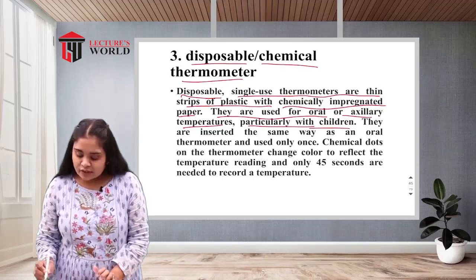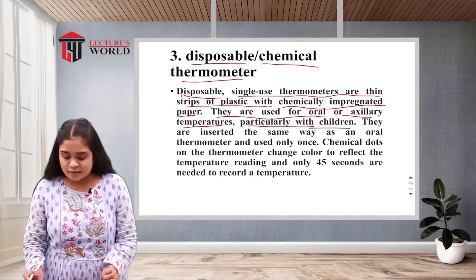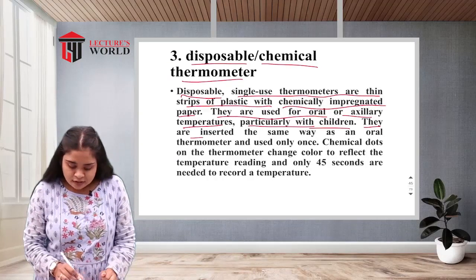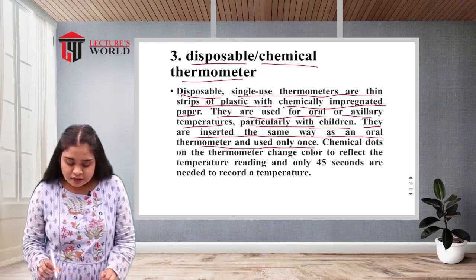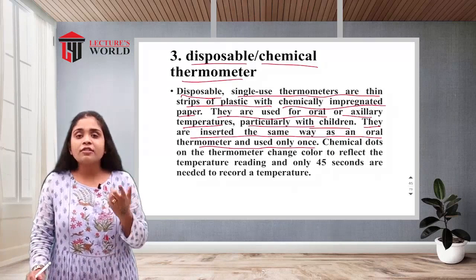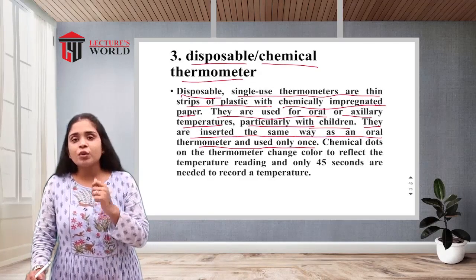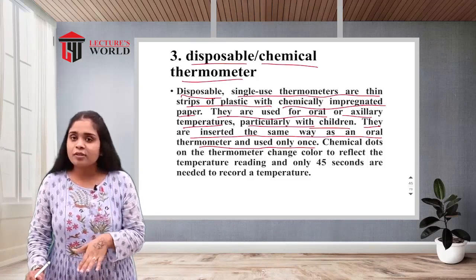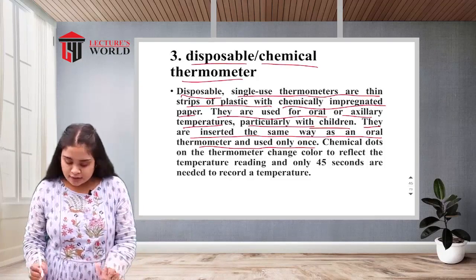Particularly with the children, mostly this kind of thermometer is used for children. They are inserted the same way as the oral thermometer and used only once. If you are checking from the oral side, the same way we insert the oral thermometer, we have to insert this disposable thermometer. For children also you can use it.